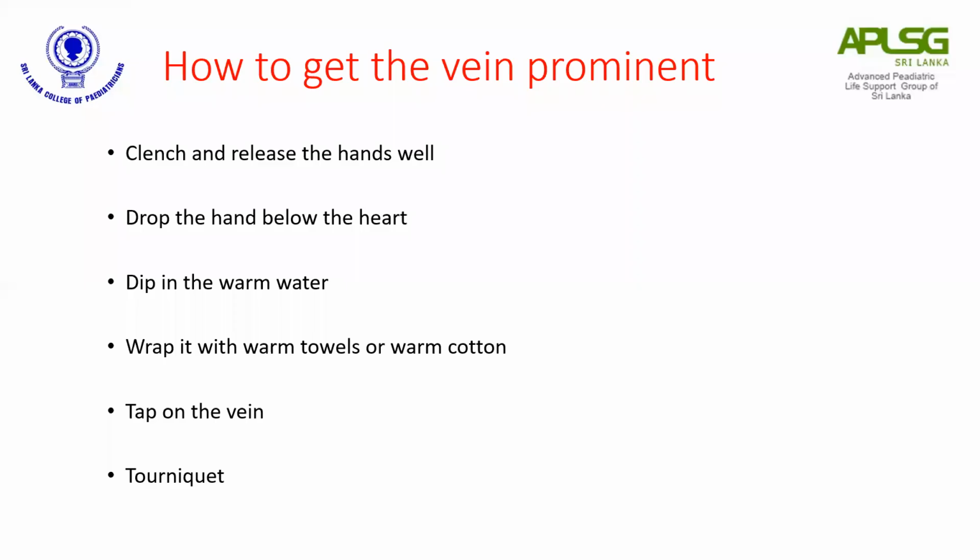Okay, so getting the vein prominent is a challenge at times. I'm sure some of you may have tried this during your clinical practice. So how can you get the vein prominent? The things that you could do is, you can ask the patient to clench the hand, to have a kind of a pumping action.